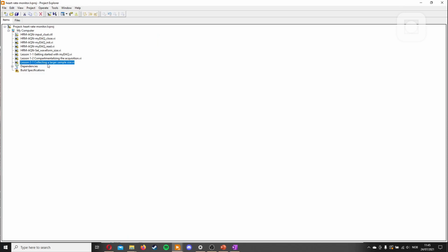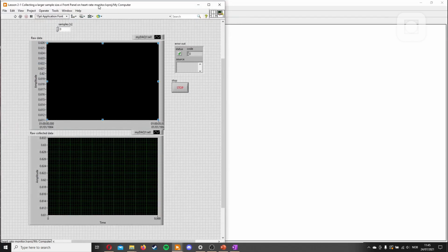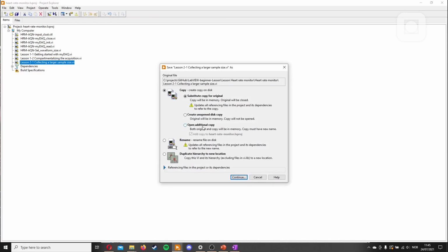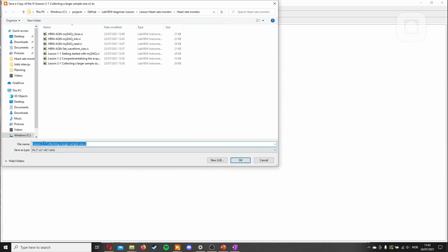We'll start by copying this one. At this point, again, you don't need to, but it is good to do just so you see the progress. You could also save it by GitHub, etc. But let's just do this. Continue, and then let's name it. And this lesson is called Filtering the Signal.